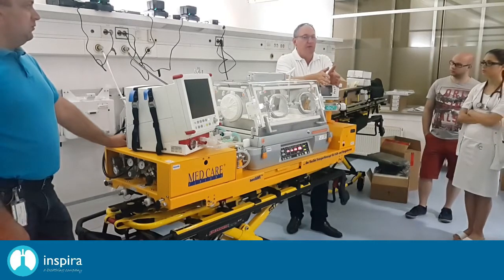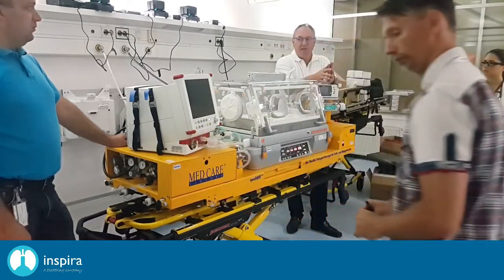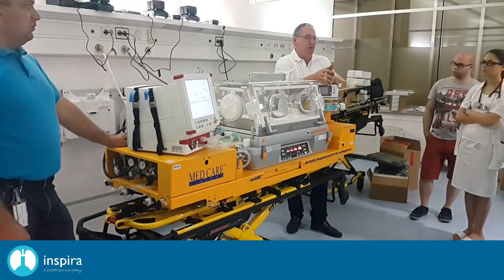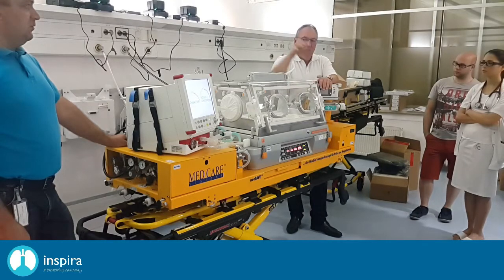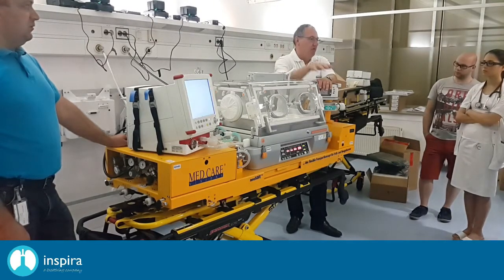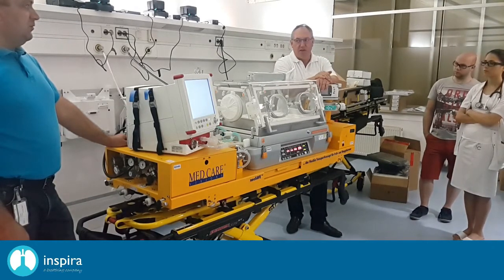The Philips monitor does have an algorithm which is called fast SpO2, but it's not a Massimo algorithm, although you can use Massimo sensors with the monitor together. So if you are going on flight transport, please use the Massimo system because this is air-proven, okay? And this is for sure, it doesn't make any artifacts.